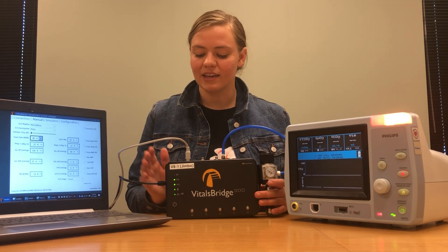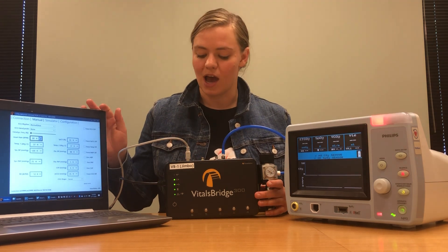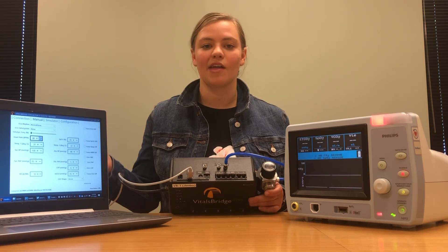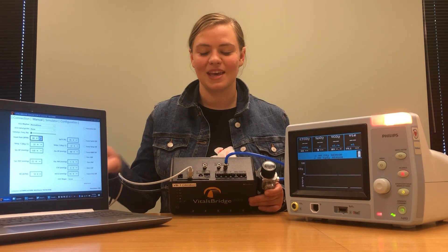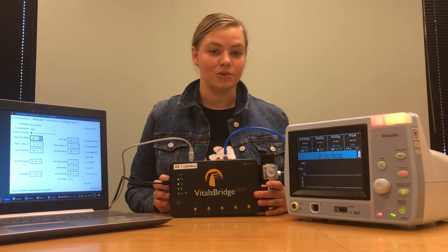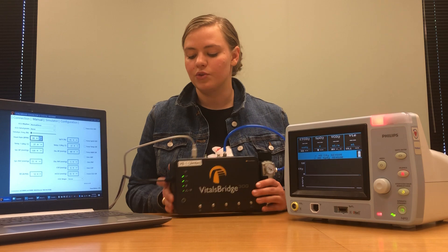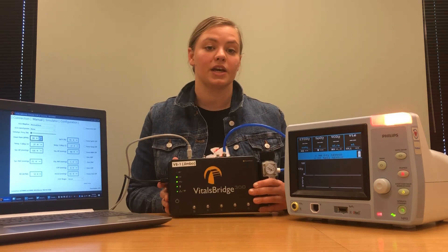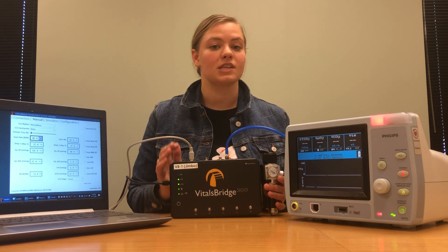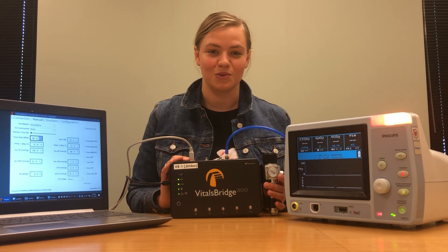Before beginning this video, I connected my VitalsBridge to my laptop via a USB cable. I plugged in the USB cable here and the other end directly into my laptop. If you want to connect via Ethernet cable or Bluetooth, both are options as well. You can connect via Ethernet cable by plugging in here and then plugging directly into your laptop, or you can connect to your laptop via Bluetooth the same way you would connect to any other Bluetooth device.